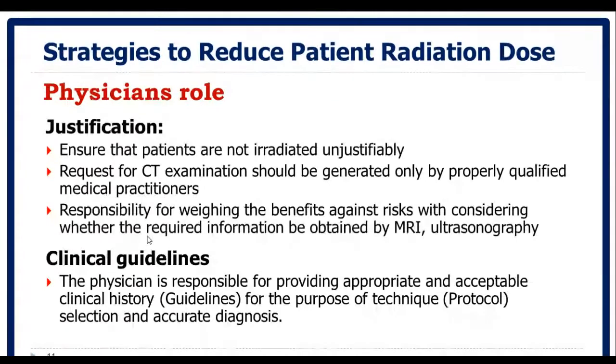For example, if I am going to apply a CT chest, this CT chest could be a high resolution CT chest, it could be a standard CT chest, it could be a low dose protocol CT chest based on the clinical remarks.